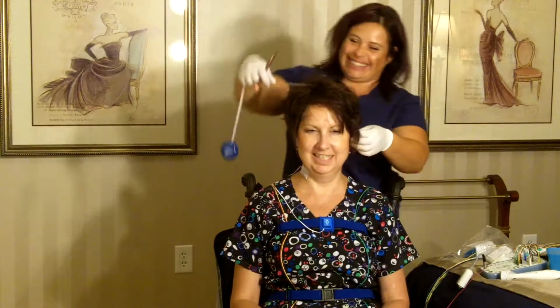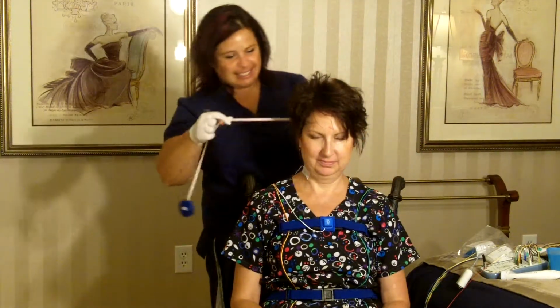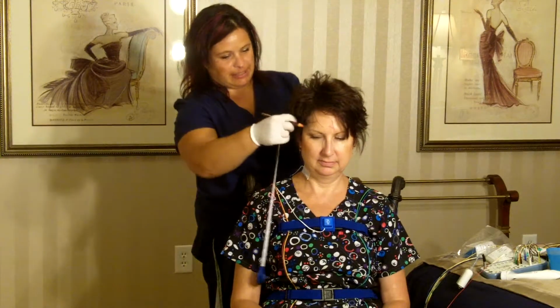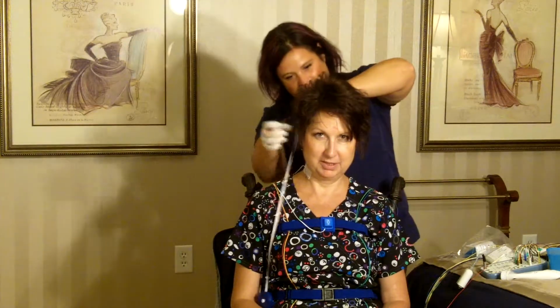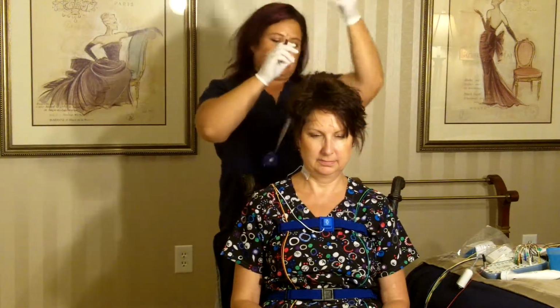Another helpful tip for your sleep study is if during the night you have any questions or requests for a temperature adjustment or a brief disconnection to use the bathroom, all you need to do is speak into the room and the built-in microphone will pick up your sound so the technologist can come and assist you. Fortunately, you do not have to remove all of the wires to get out of bed if needed. The technologist only needs to disconnect 2 cords for you to be mobile.